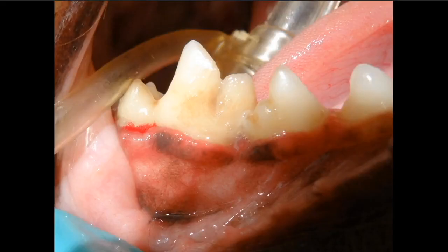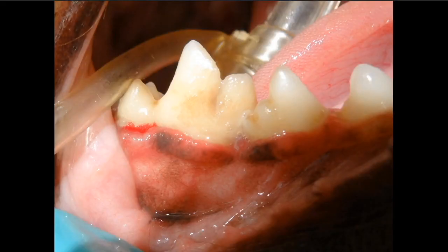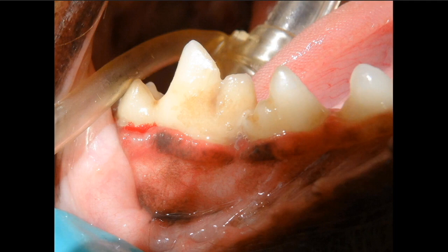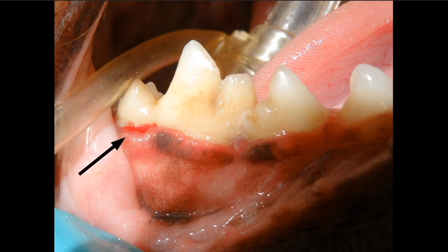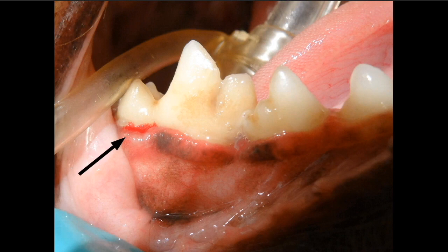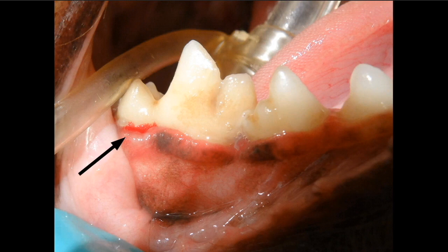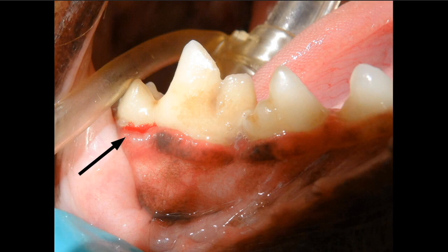Let's look at another case. That one's a little more obvious. We've got an area that's bleeding on probing and pretty inflamed. If you look a little further where the shadow is between the molar and the fourth premolar, there's some inflammation there, and some inflammation in the furcation that are less obvious.